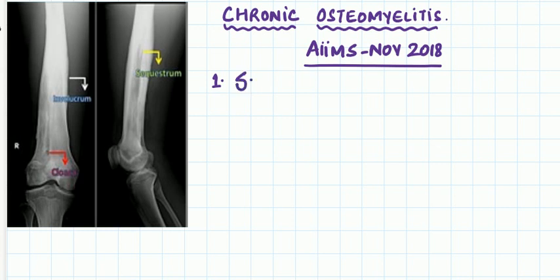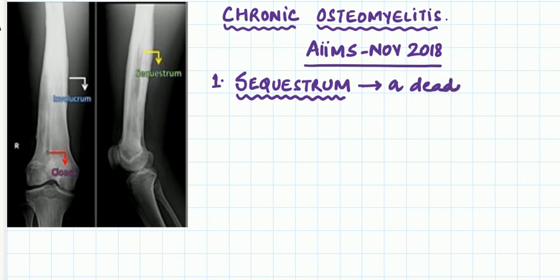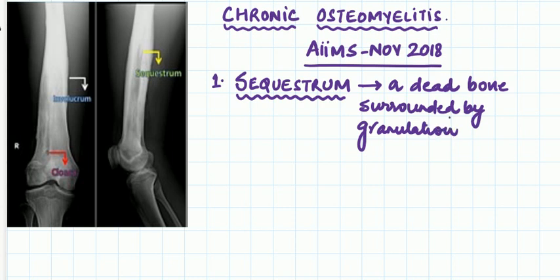The hallmark of chronic osteomyelitis is the sequestrum. We all know the definition, but we should also know how it looks on X-ray. A sequestrum is basically a dead bone surrounded by granulation tissue. If you look at this femur, under the circle drawn, you can see a white projection of bone — that is what you call a sequestrum.